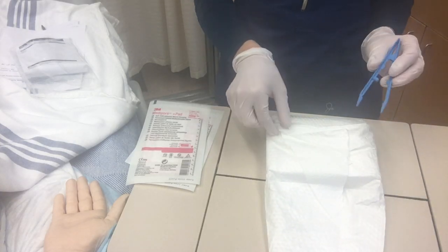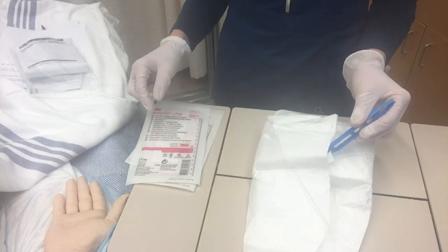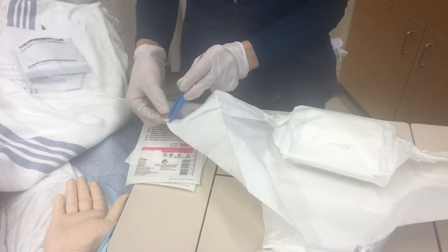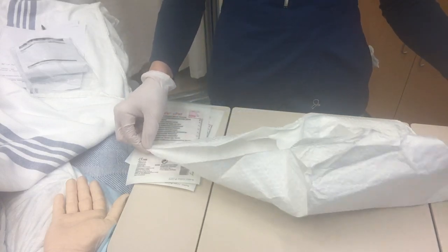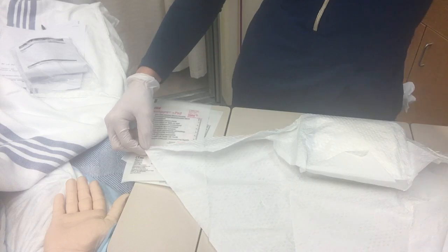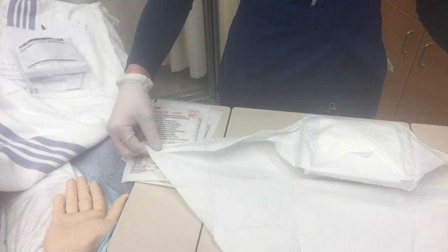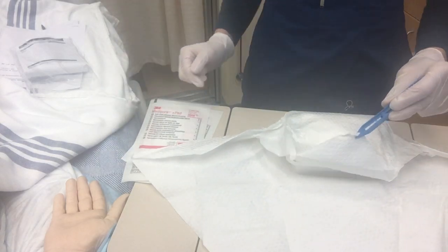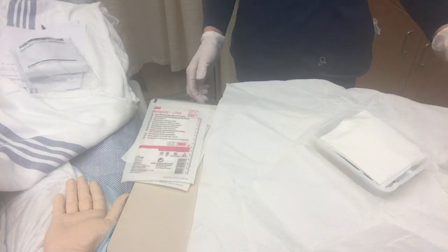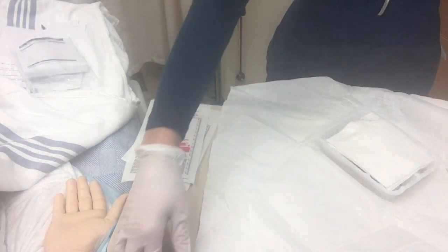And then using my forceps, I'm going to pull these out, trying not to do any unnecessary reaching over my field. And then the last tab I'm going to pull towards myself as I step back. And then I'm going to turn it.